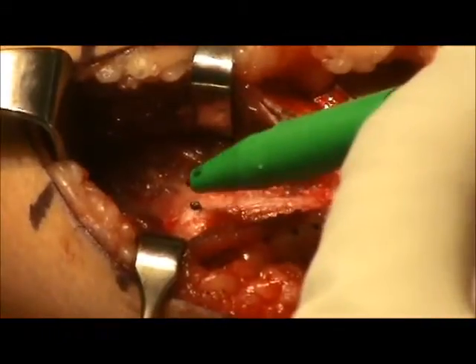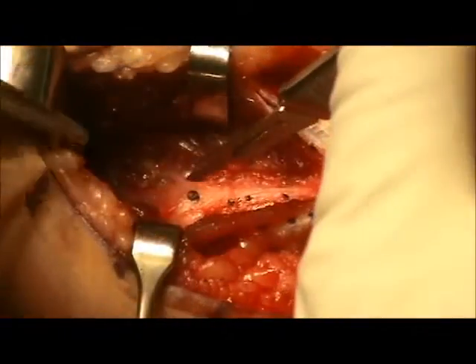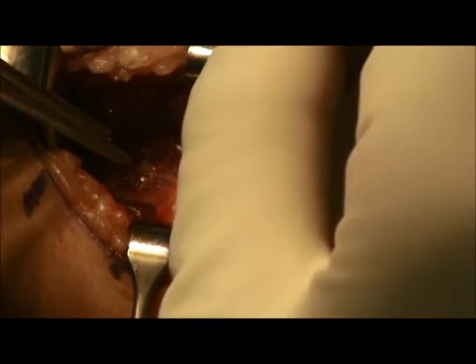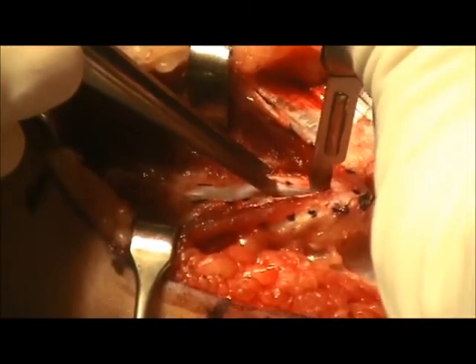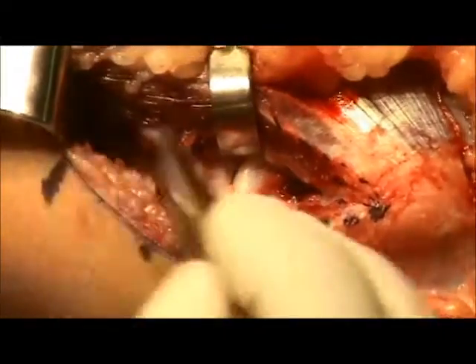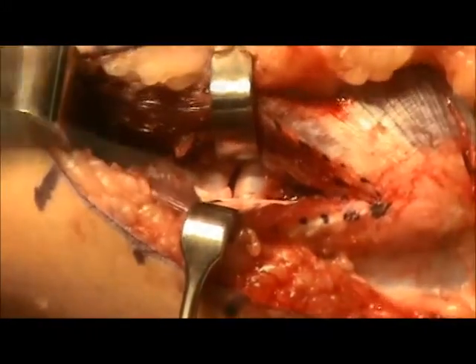Next, the native ulnar collateral ligament is outlined with a marker, and then an incision is made sharply from the sublime tubercle directly to its attachment onto the medial epicondyle. The ligament is then assessed for injury, either intrasubstance or attachment site injuries. Here you can see it is detached distally, and with valgus stress there is opening of the ulnar humeral joint, indicating insufficiency.